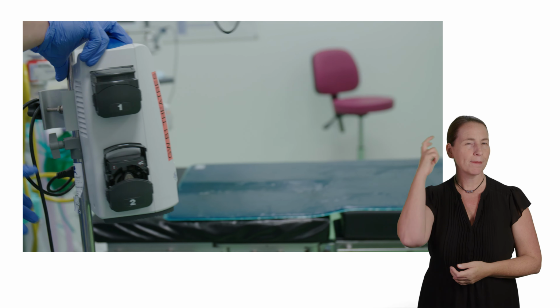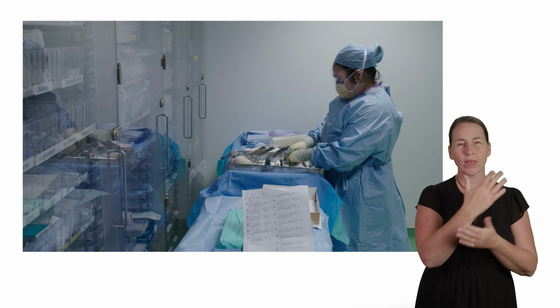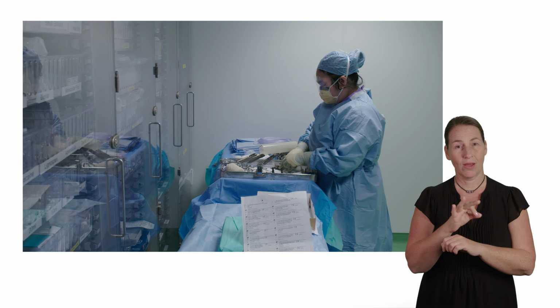Cochlear implant surgery on average takes between an hour and a half to 2.5 hours. And so depending on when you have your operation, perhaps in the morning, the expectation is you will go home later on in the afternoon. If perhaps you're a little bit later on in the afternoon to have the surgery, then you might need to stay one night. It's extremely rare for patients to stay more than a night. When you're ready to go home, you will be going home with a bandage on your head that we will ask you to take off the following morning.